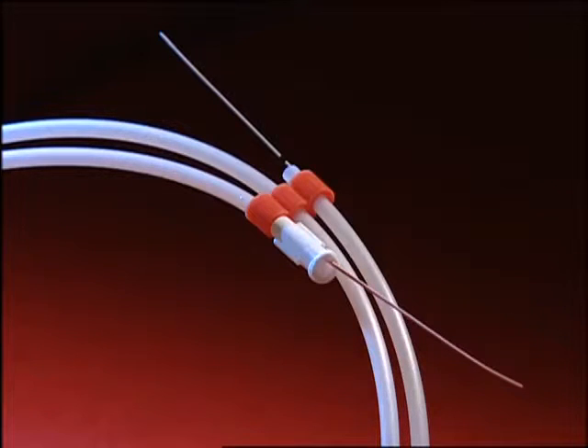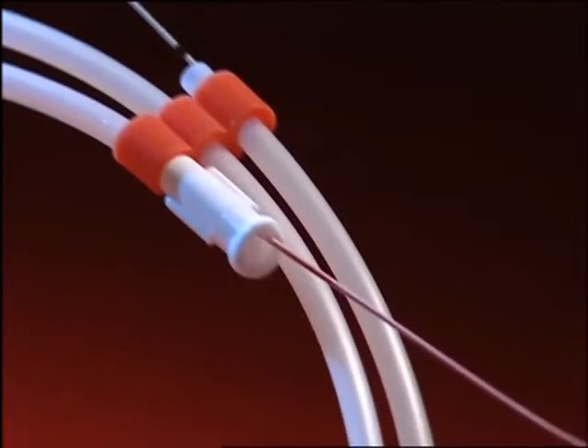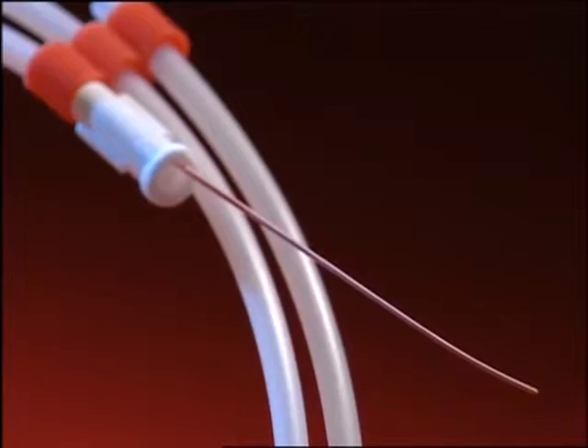The double floppy tip wire is specially designed for flexible ureterorenoscopy. It is atraumatic to the ureter and to the working channel of the endoscope.